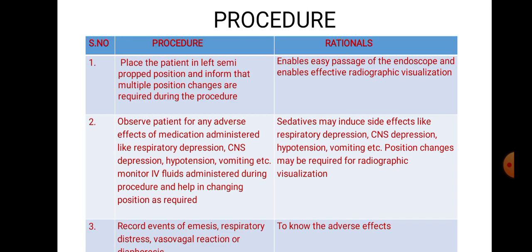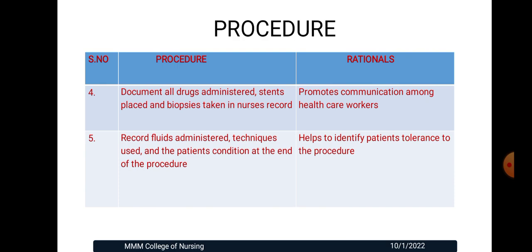Record events of emesis, respiratory distress, vasovagal reaction or diaphoresis. It will help to know the adverse effects. And document all drugs administered, stents placed and biopsies taken in the nurse's record to promote communication among healthcare workers, and record the fluid administered, techniques used and patient condition at the end of the procedure. It helps to identify the patient's tolerance to the procedure.